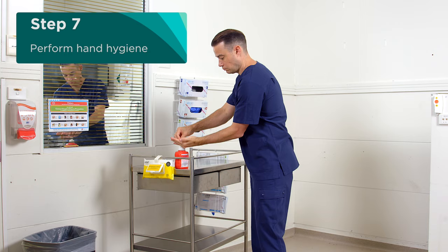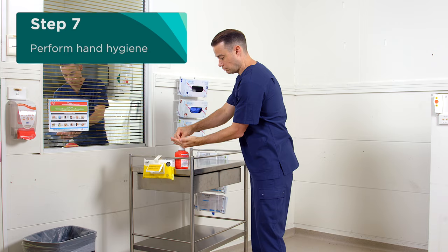Now remove your mask by removing the loops or untying the straps, taking care to keep the mask away from you to avoid contamination. Discard the mask into the general waste bin and perform hand hygiene. You have now completed the steps required to doff your PPE.